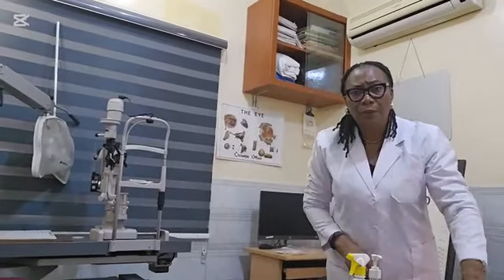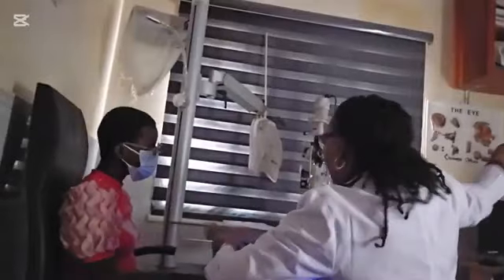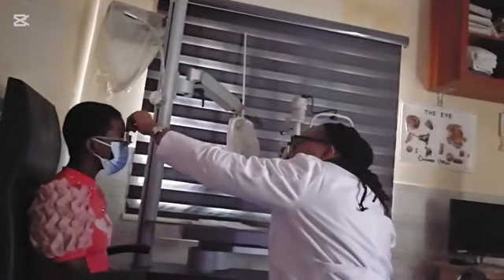So let's do a refraction. Look at that spot of light. Good.